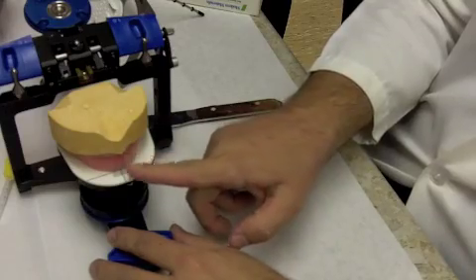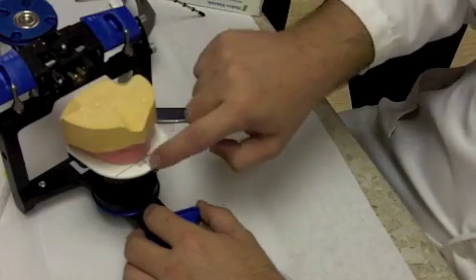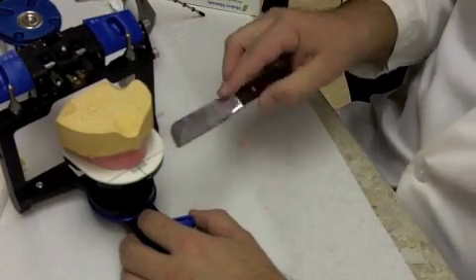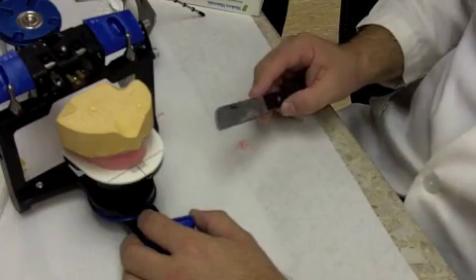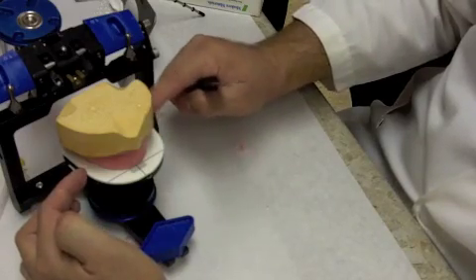We want to line that up with the frenum attachment, so we want to make sure that we're centered there with the frenum attachment on our simulated patient. Then this other line that goes across the anterior relates to the same thing as that white wall, so we want it just touching that.